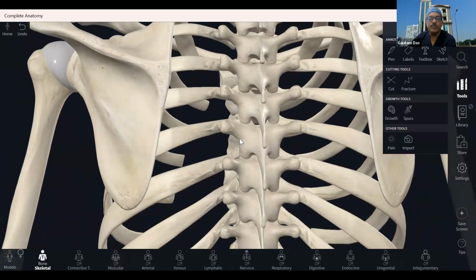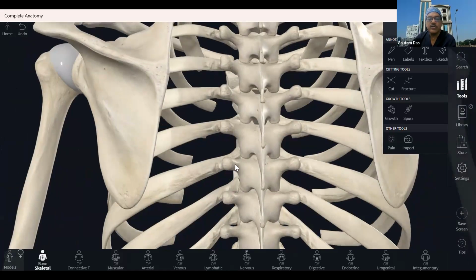So when I am at this edge, the gap between these two hyperechoic bone lines will suddenly increase. That is the lateral edge of the spine. So that is not the facet joint area. You have to go a little more medially to come to this point. And then suddenly there will be a slope for the transverse process. Is it clear now? Yes, sir.